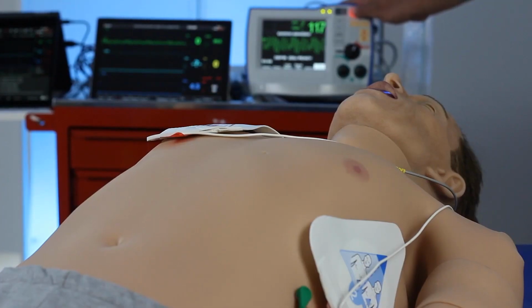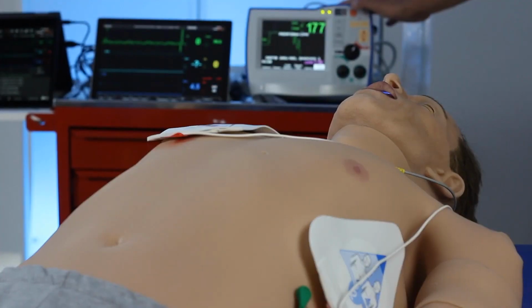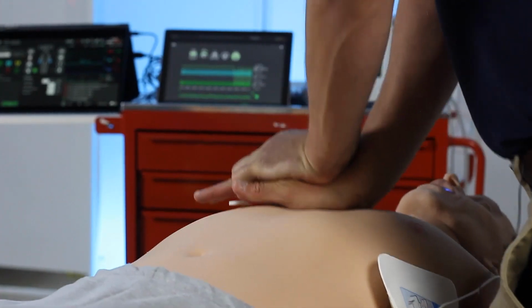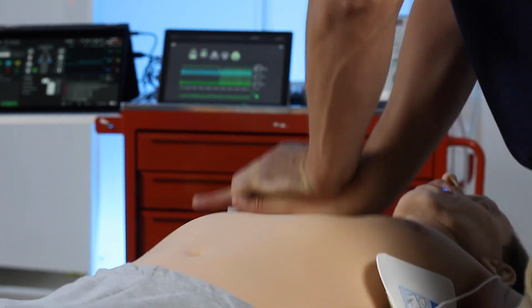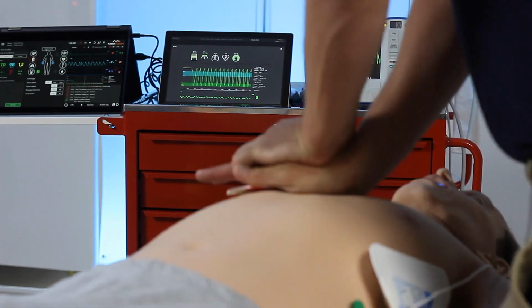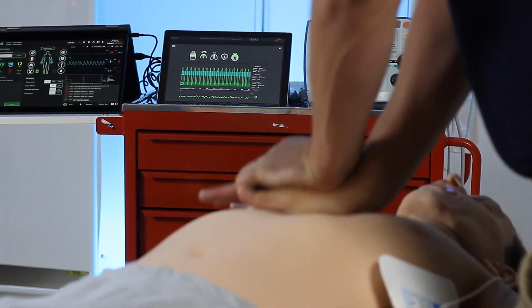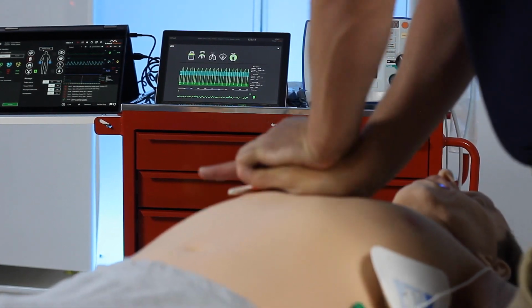Everybody stand clear. Perform CPR. We're now going to perform some CPR, and what you'll see on the patient monitor is that we also have a CPR meter that's built in, that's looking at rate, depth, recoil and hand position.